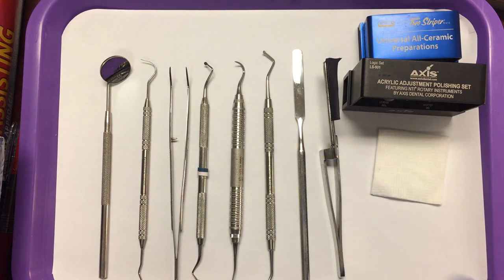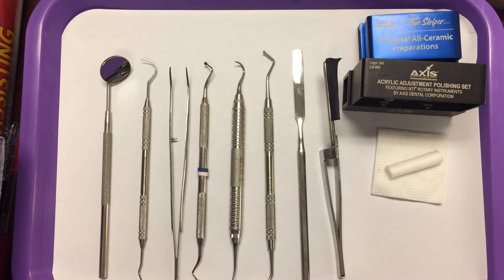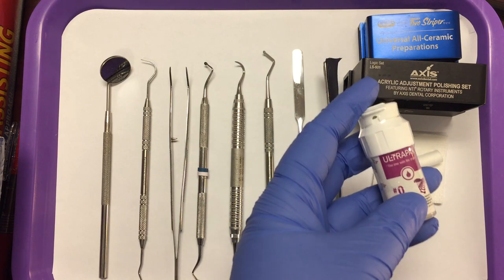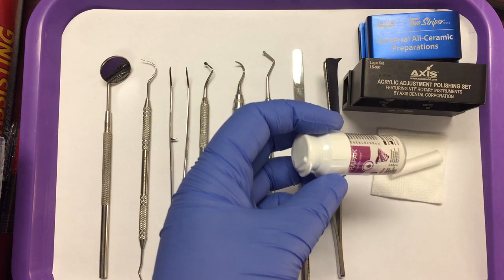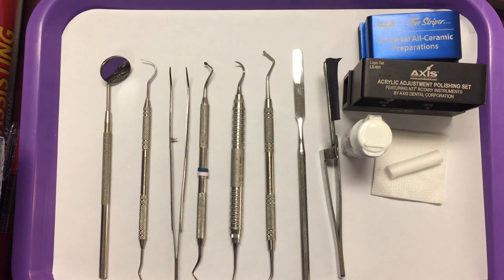We need our gauze and cotton roll. Usually you'd have multiple cotton rolls — that is for moisture control and isolation. We'd have our gingival retraction cord. Typically you would cut a length of cord; you wouldn't put the whole container out. The retraction cord is used to widen the gingival sulcus. We need to widen that sulcus so that the impression material will be able to flow freely around the tooth to capture a very accurate impression.